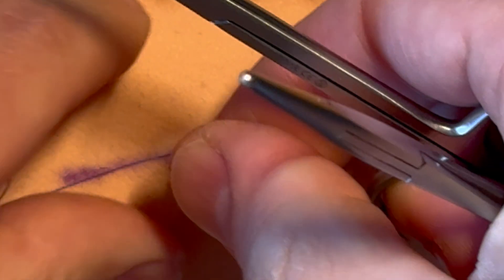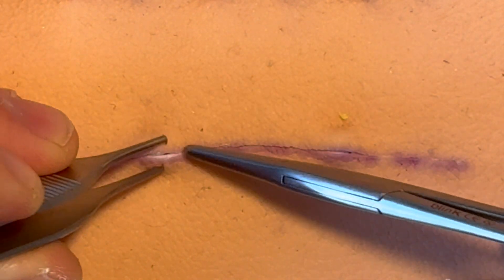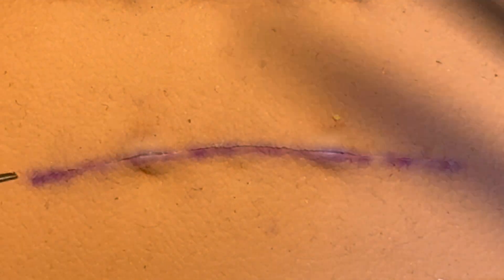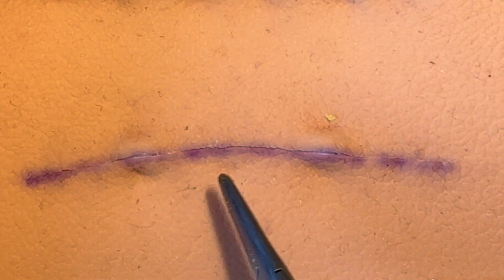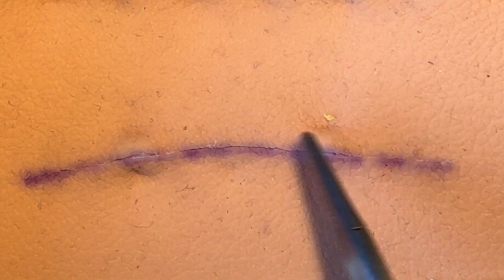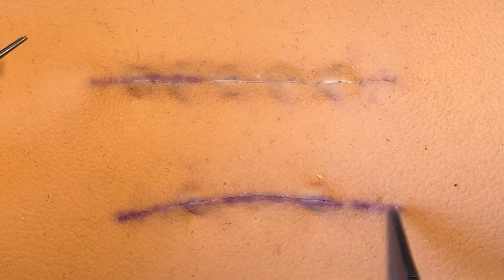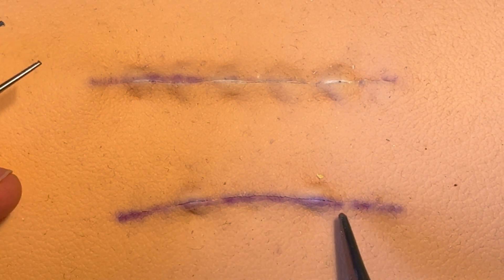Then just snip that off flush again — it pops down nicely. You can see there we've got a lovely eversion, really pushed up wound edges, really nice dimpling, and we've actually closed a wider area. So you can often get away with putting fewer of these buried stitches in. Basically repeat that until all the wound is closed.